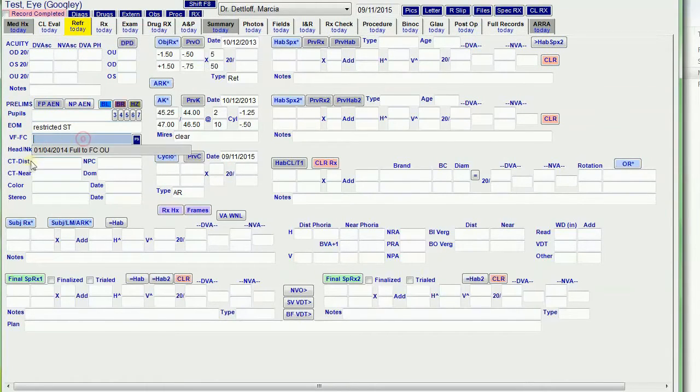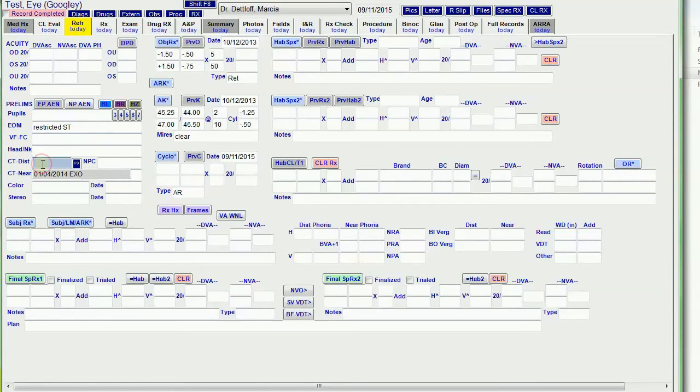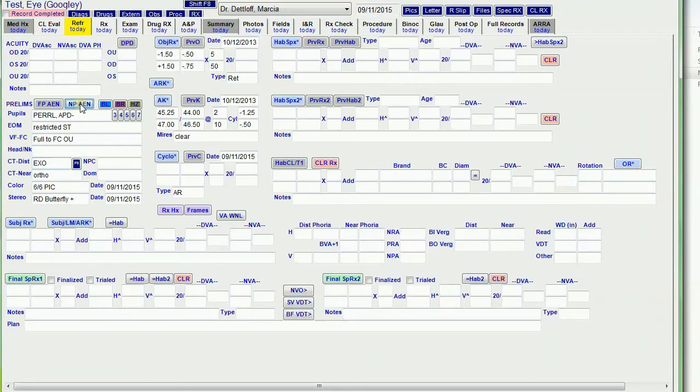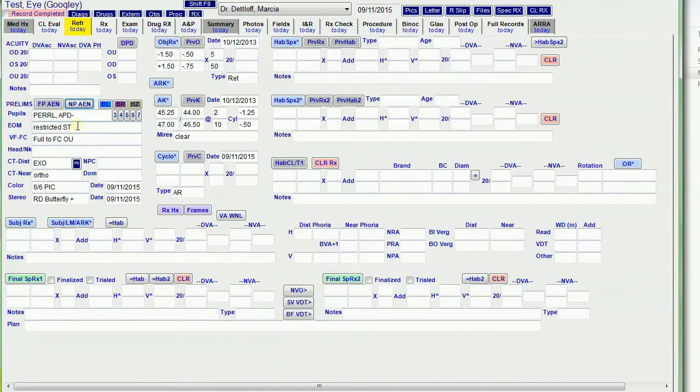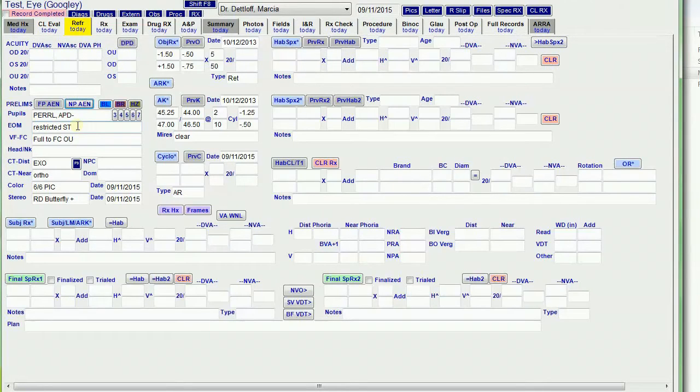And then for a new patient, I hit new patient all else normal. It assumes that the pupils, the versions, the confrontation fields, phorias, color vision, and depth perception are normal.